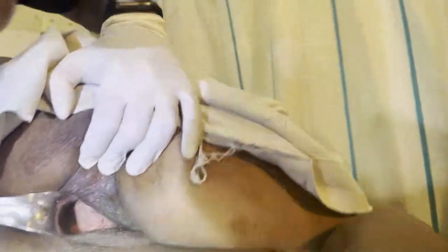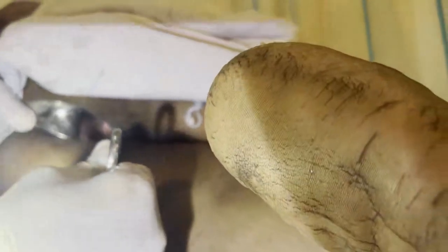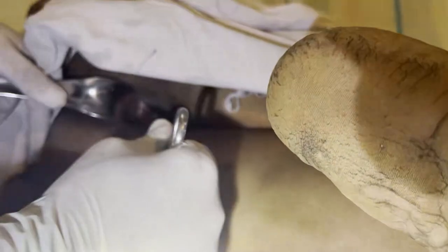I hold the speculum and insert it from the posterior side. I then use the sponge to retract and you can see the anterior vaginal wall prolapse is present. To see the posterior vaginal wall, I hold the anterior vaginal wall with the sponge forceps and slowly take out the Sims speculum — you can see it comes very much out, so there is a rectocele as well.